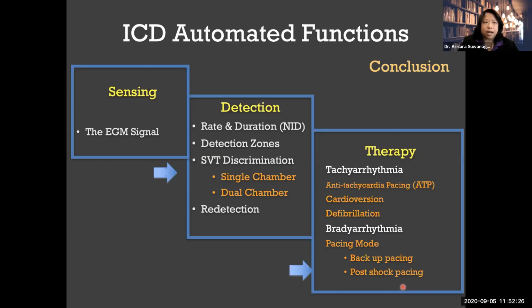So now it's up to you guys to make sure that you have a good setup for the patients and make sure that the patients will not receive any inappropriate shocks.